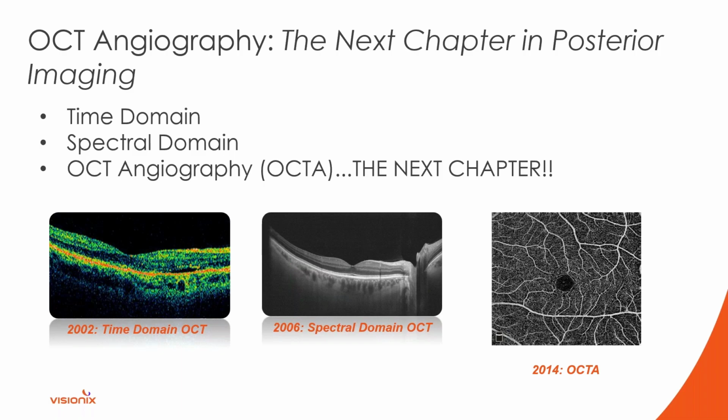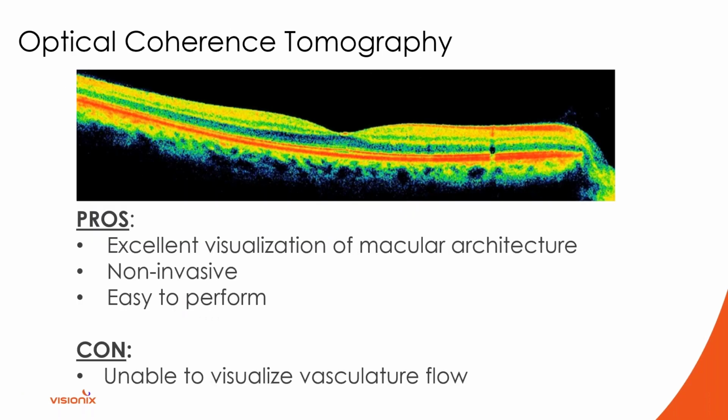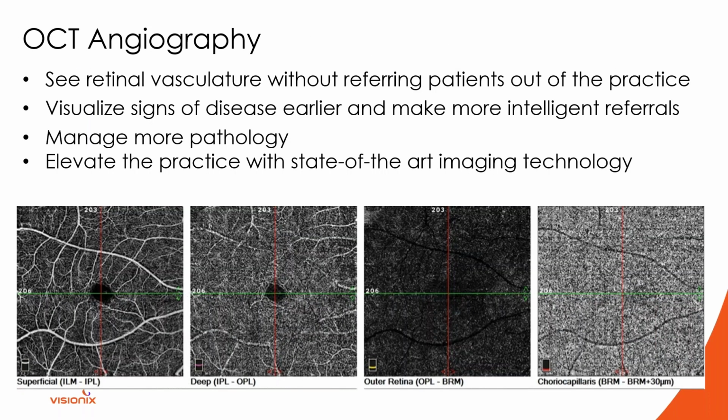Okay, so the frightening part about OCT angiography is obviously looking at this image and saying, I don't know what I'm looking at. And that's fair, right? Because it's a completely different image than what we're accustomed to seeing with an OCT scan. Pardon me, went too fast there.